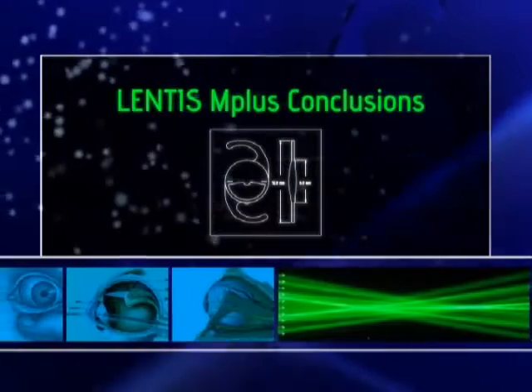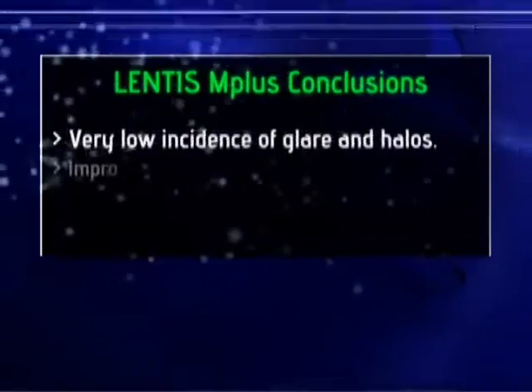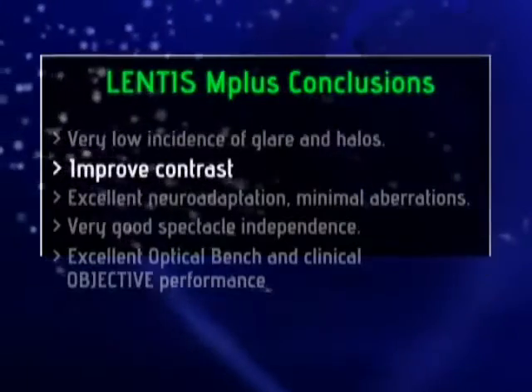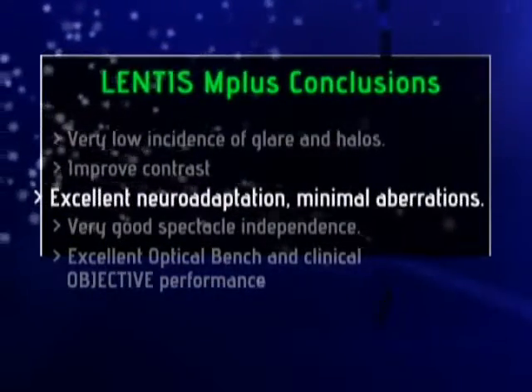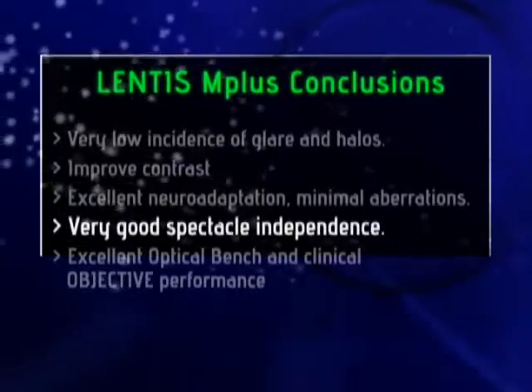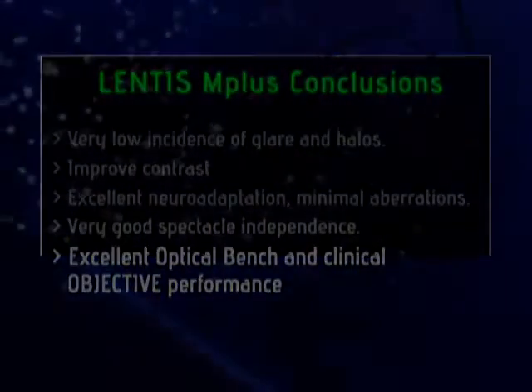In conclusion, using this new concept of multifocal IOL, we have obtained excellent visual outcomes for all distances with a very low incidence of halos and glare, and improved contrast sensitivity by reducing the loss of light, with excellent neuroadaptation, minimal induction of aberrations, and very good spectacle independence, with excellent objective optical and intraocular clinical performance.